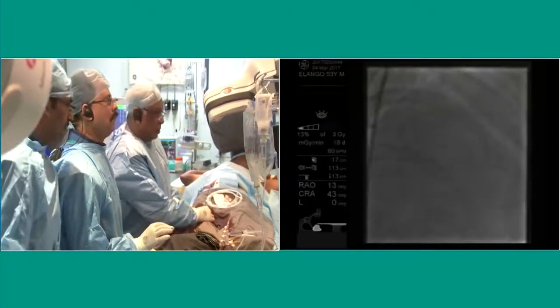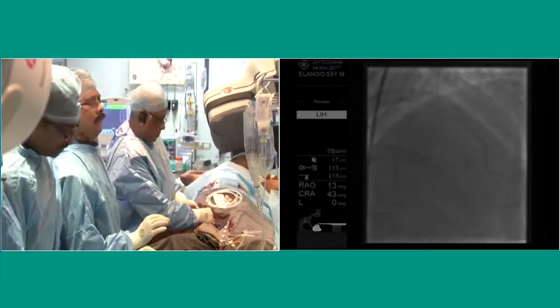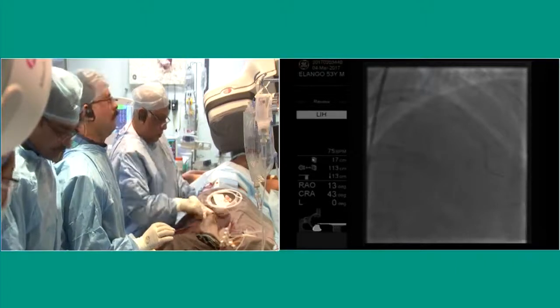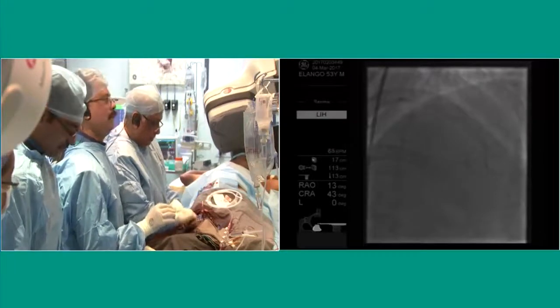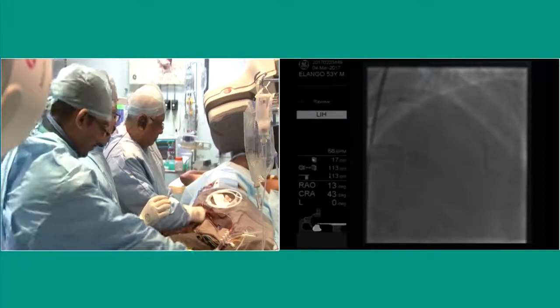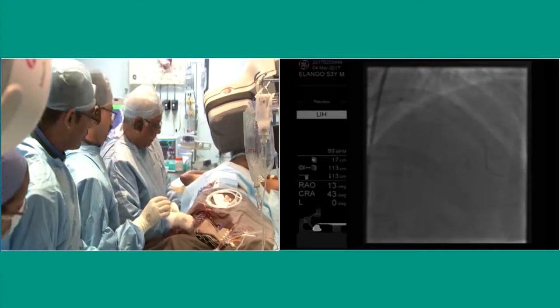Now, Mathew, while you've got this one wire, try getting your stent into the diagonal. Yeah, okay, that's a good idea. I'll do that, but I want at least... You'll get the other wire down. No, don't implant it. You're saying try and get it into the diagonal. Yeah, it gives you the perspective of whether there's anything else obstructing you.